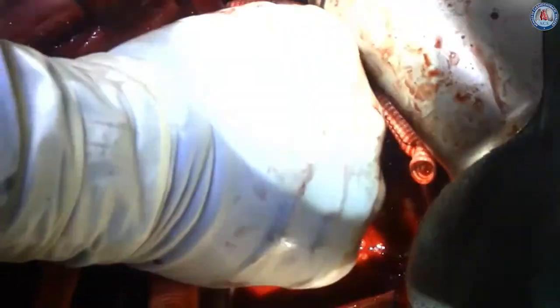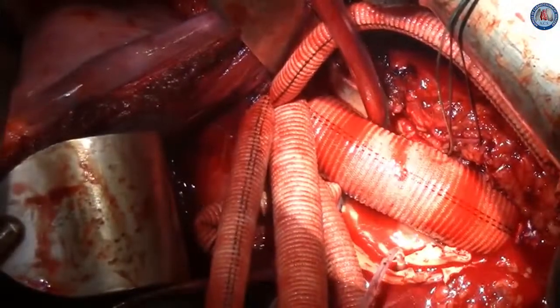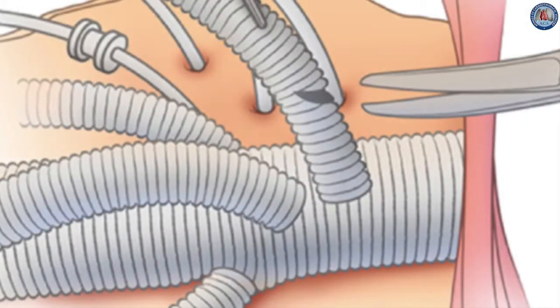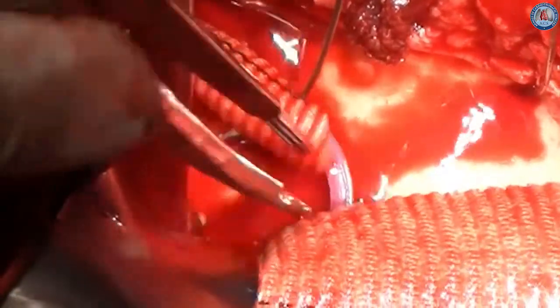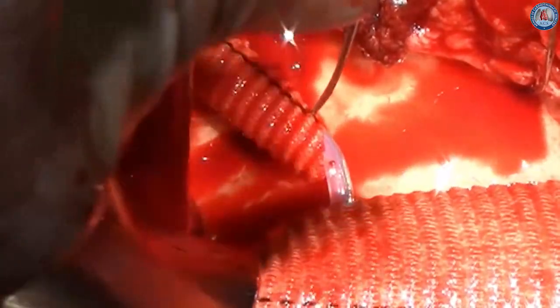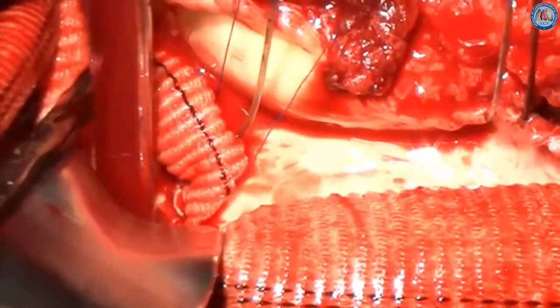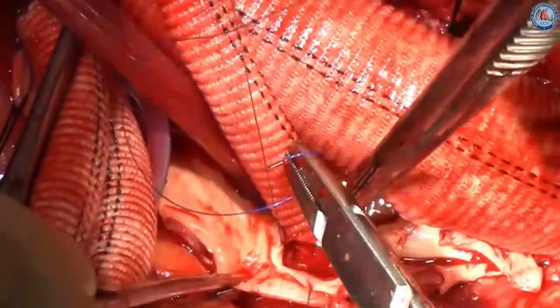The anastomosis is then completed and the graft de-aired, re-establishing flow to the pelvic circulation. Distal aortic perfusion will be continued to allow warming of the patient to 35 degrees Celsius. The grafts are then cut to the appropriate length and sequential anastomoses are performed. In this case, the right renal artery is first reattached, then the left renal artery, followed by the superior mesenteric artery, and finally the celiac axis.